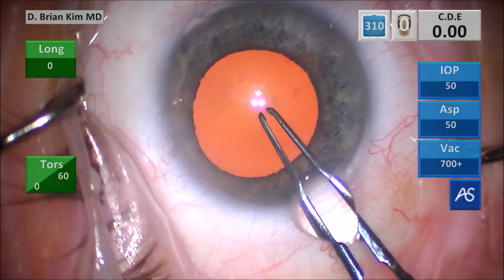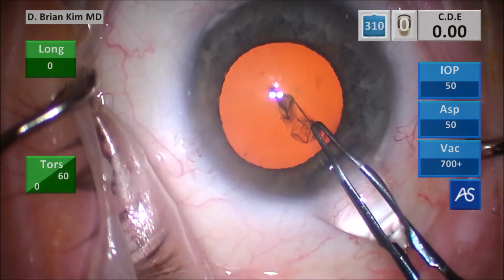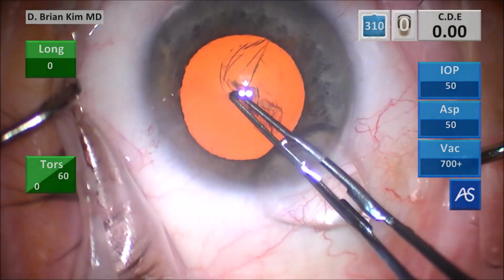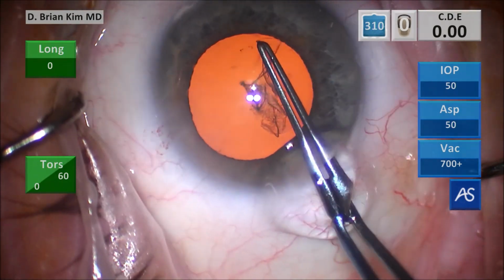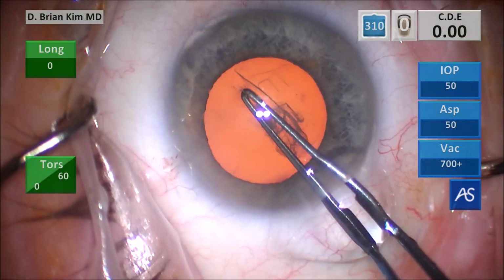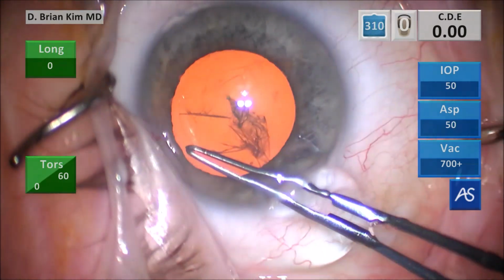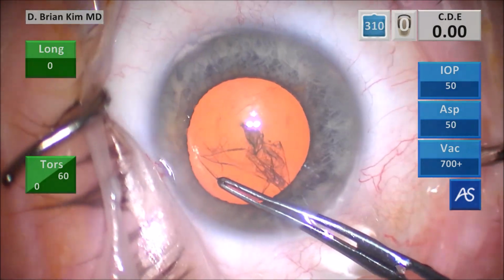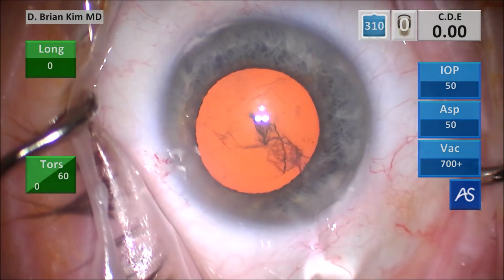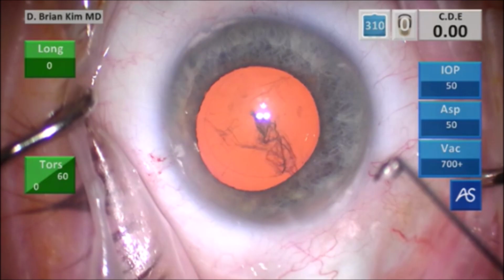I'm going to puncture the center, pull it down towards me, grabbing the right side of the tear, which creates a flap. I'm able to control the diameter of the rhexis by doing it this way, going around circumferentially, grabbing and re-grabbing, making sure I follow the marks on the cornea that I made before, which will help me to center and size the rhexis. Burp some viscoelastic at the end. So this is tip number 1.